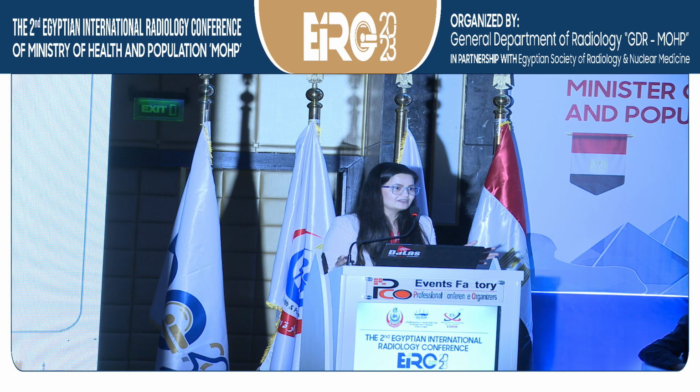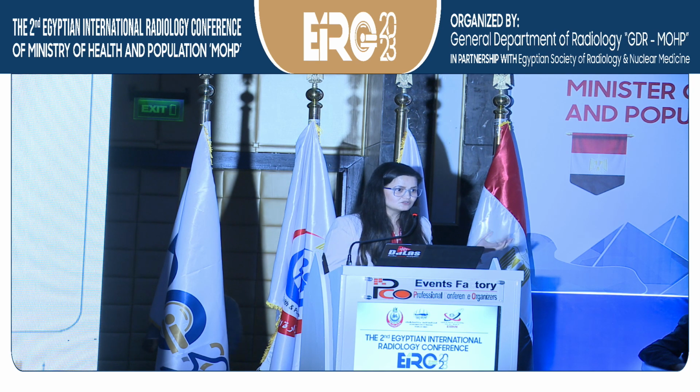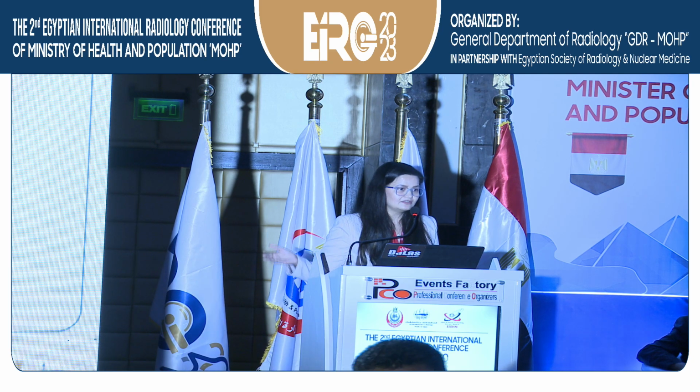So this is how it really helps: to our eyes, just by looking at the ultrasound features, it looks like fatty, but when you have done the fibrosis assessment, you understand that, oh no, it's not just fatty, it's going into early fibrosis. Yeah. Thank you.